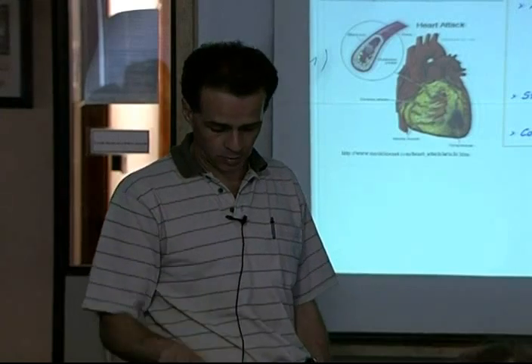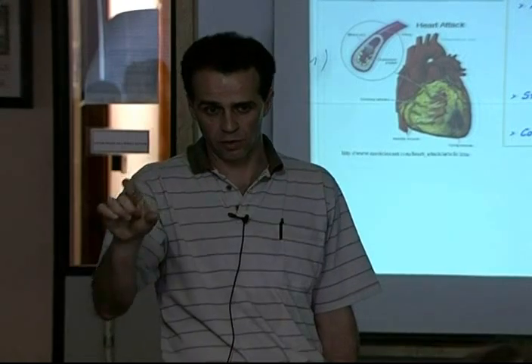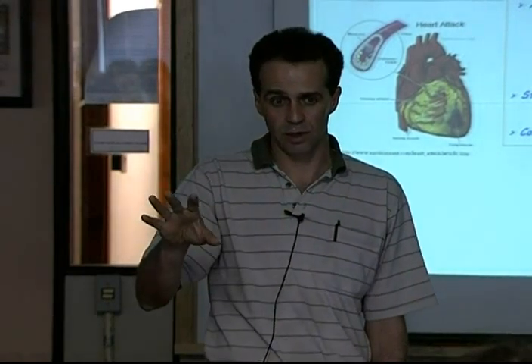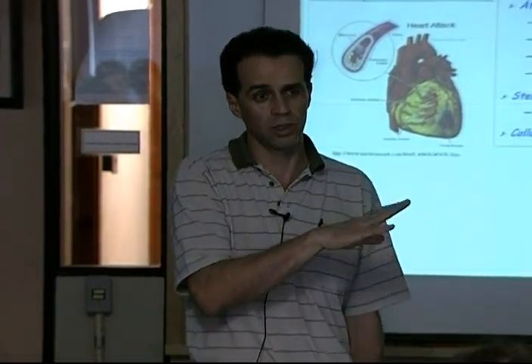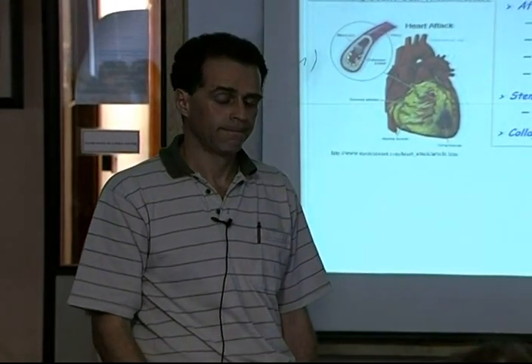So we're hoping to use the wavelength properties of the polarized light as opposed to just wavelength properties of the diffuse reflectance to do everything that diffuse reflectance can do, because we can still measure the intensity as a function of wavelength, but now we have all this polarization information and some polarization knowledge of how to interpret those signals. So the idea is to do a wavelength dependence.